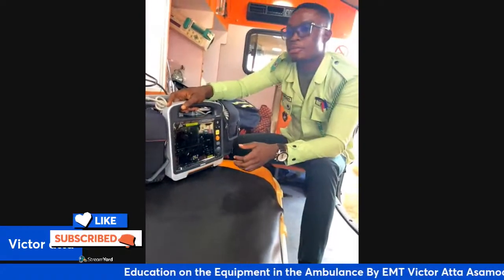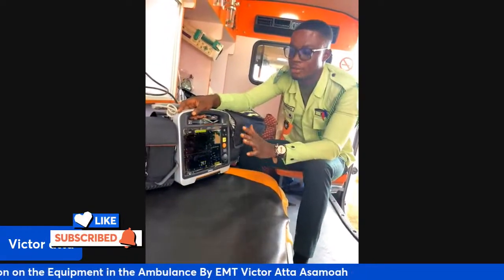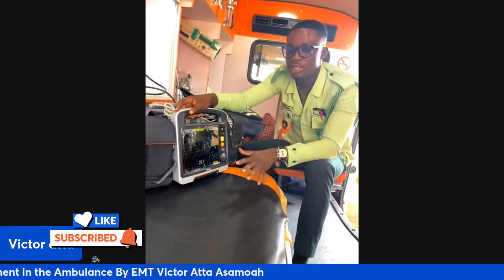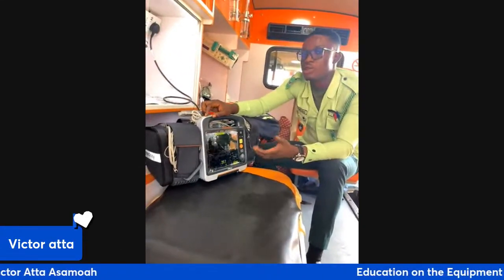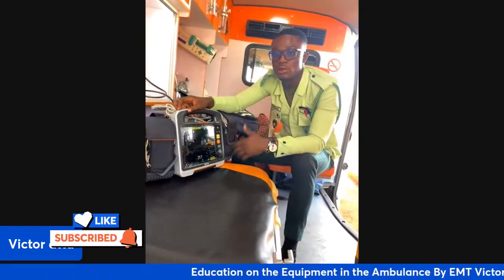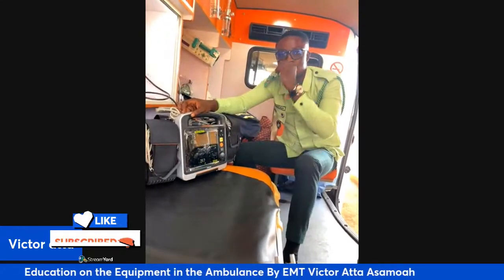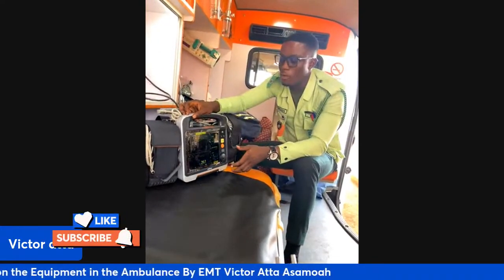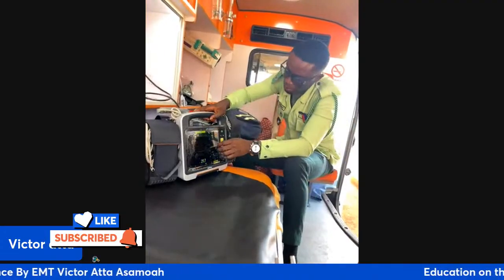We have some monitors that do not have the CO2 on them, but this one helps us to see the CO2 whenever you're taking care of a patient and the patient's condition is deteriorating. This machine will allow you to know whether the patient is alive or not alive.